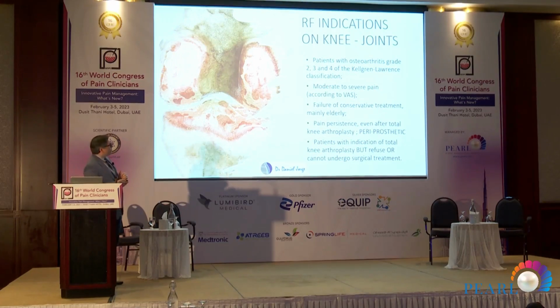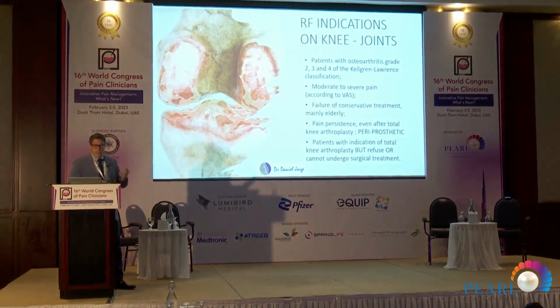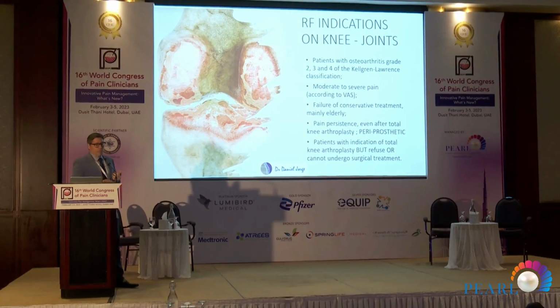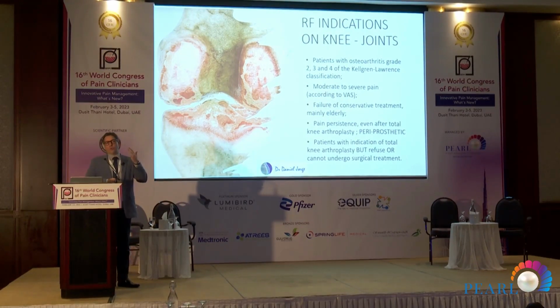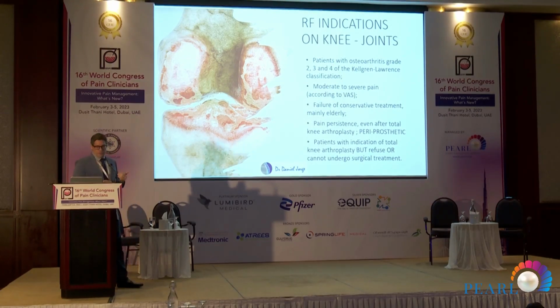And for the knees we have some good indications as well, as we saw before with Professor Fipiades yesterday, for Kellgren-Lawrence 2, 3, and 4 osteoarthritis, and for those patients who don't want to go to surgery or have some clinical complications that prevent them from going to surgery.